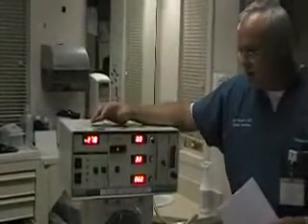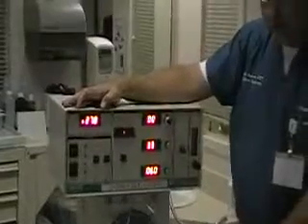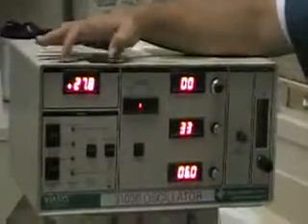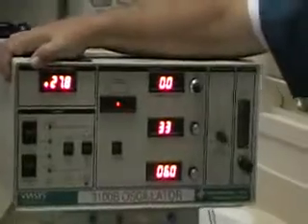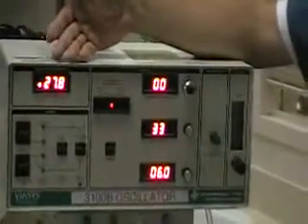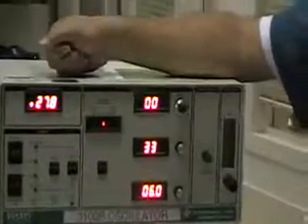As far as oxygenation is concerned, your mean airway pressure is going to determine your oxygenation. This and your FiO2, which is set on your blender. So you're going to set your mean airway pressure on the oscillator to begin with at 5 centimeters of pressure above what your mean airway pressure was on your conventional mechanical ventilation. So in this case, if we had a conventional mean of say 22 or 23, then 27 or 28 would be appropriate to start as a mean airway pressure.